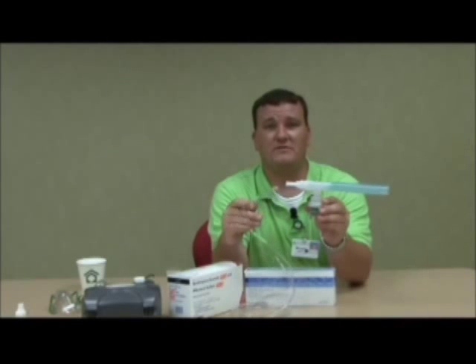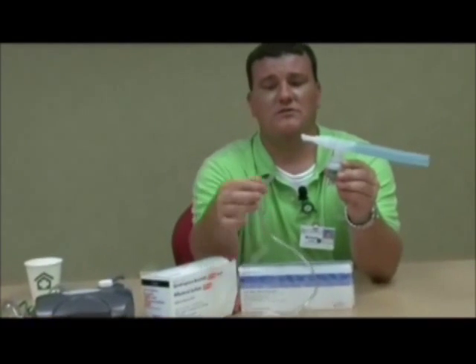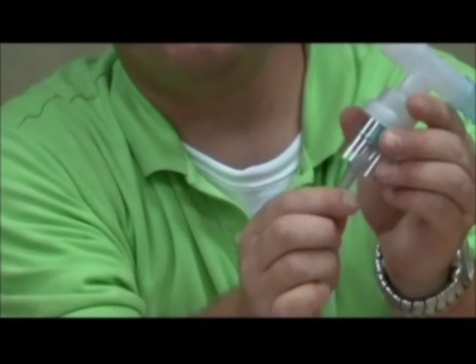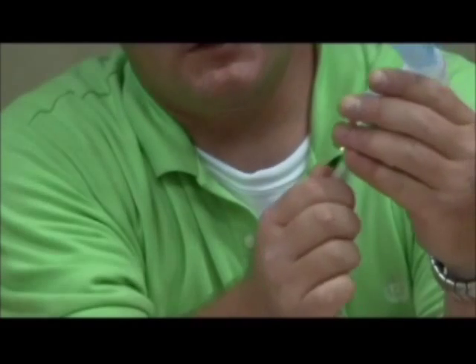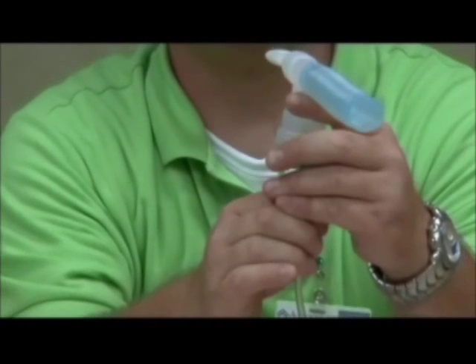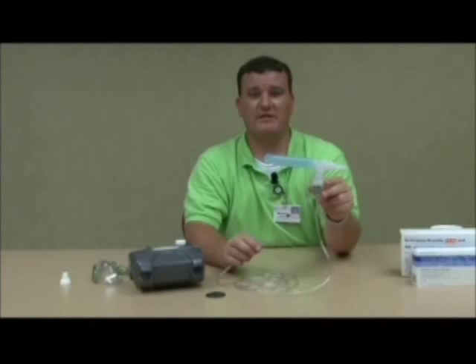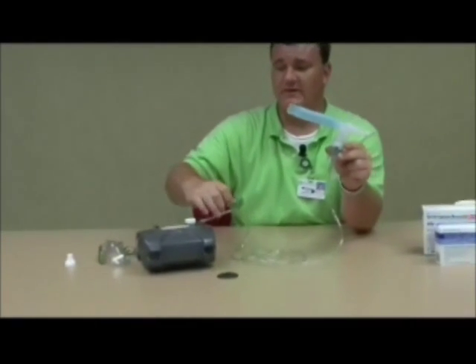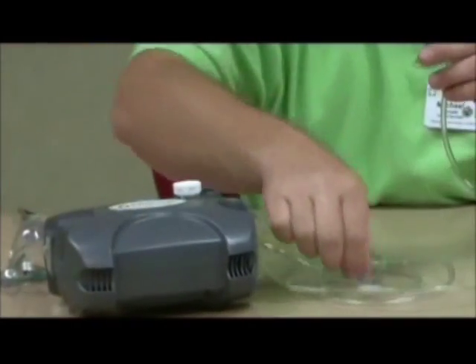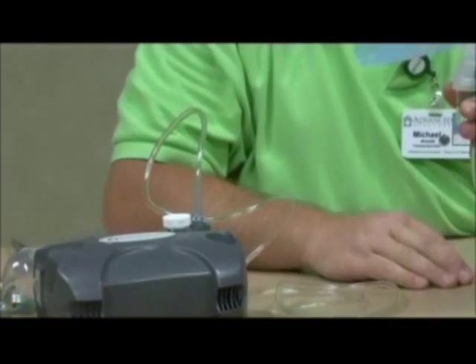Next, you will need your nebulizer kit tubing. They both have the same ends, so it doesn't matter which end you use first. Just use one end and connect it to the bottom side of your nebulizer kit. I recommend giving it a little twist as you push down to get it as snug as you can, because sometimes a compressor will blow it off. Once you have your nebulizer tubing attached to the medication cup, you will then need to attach the other end to the nipple adapter on your nebulizer. Again, twist and push down to get a snug fit.